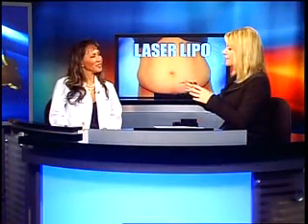When you do this, is there ever a case where the patient does feel it, and you have to stop what you're doing and put in more anesthesia? Actually, what they're feeling is the pressure of my hand where I'm pressing against their belly. So they get nervous? Yes, they get nervous. They don't know what it is, but it's my hands and the probe going in and out, but they don't feel that. It's completely numb.